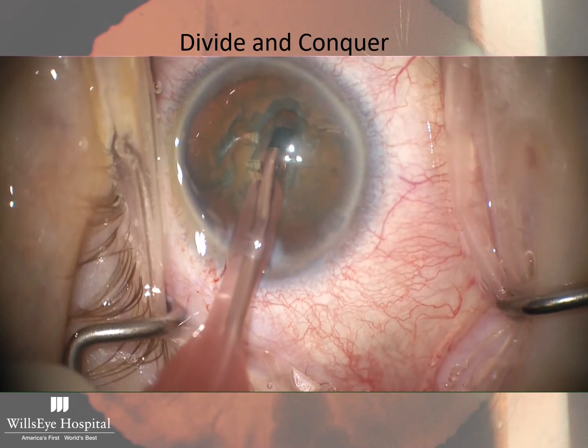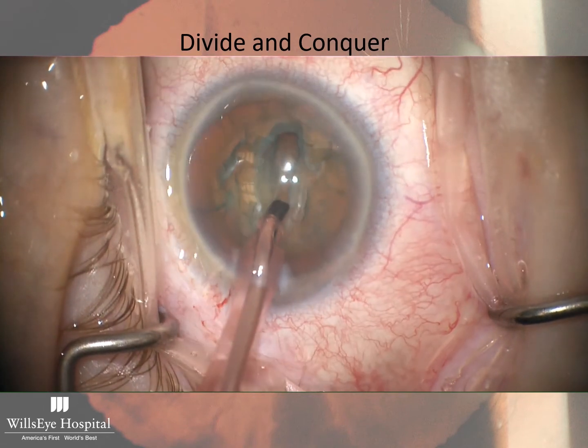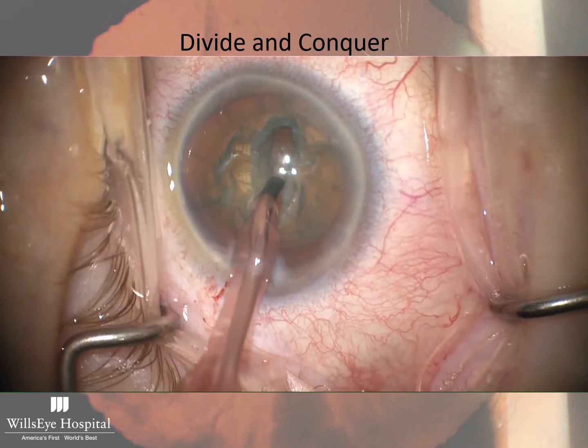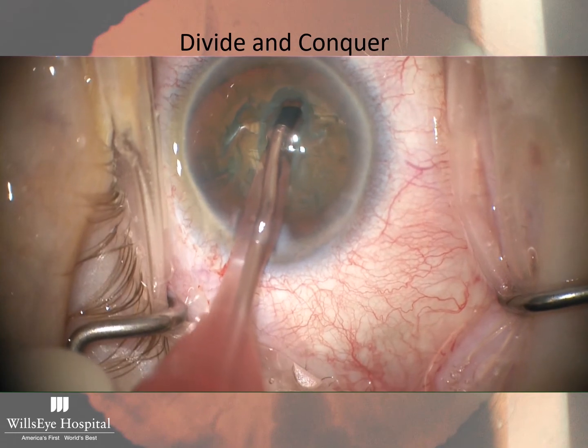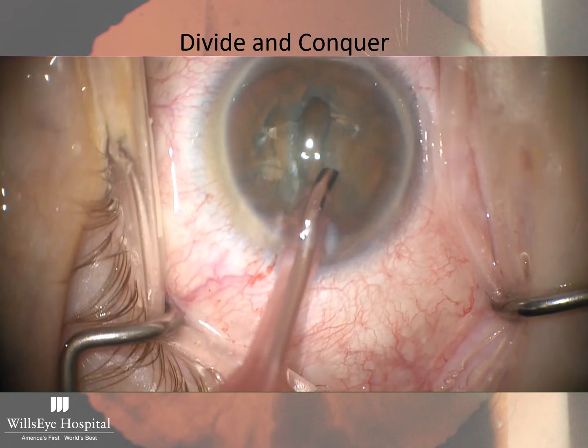I'm taking deeper and deeper bites. As I'm going deeper and more posteriorly, I'm not extending as far because remember the posterior capsule is rounded. If you extend more peripherally as you're posteriorly, it's more likely you could go through the capsule.